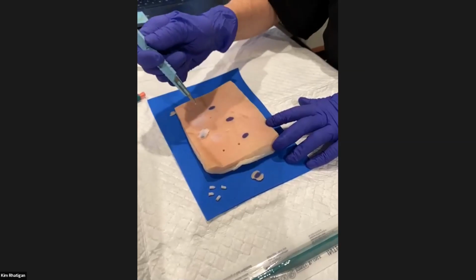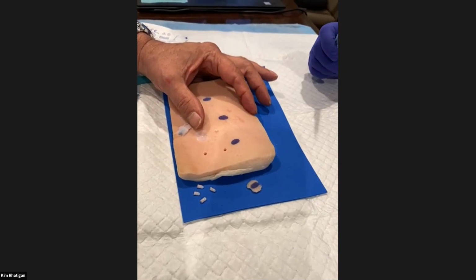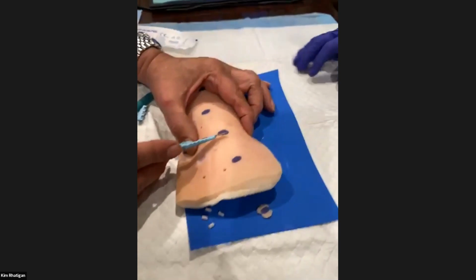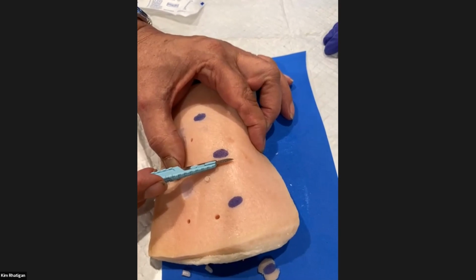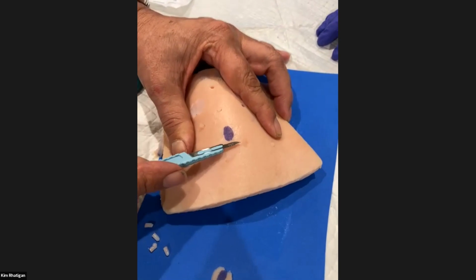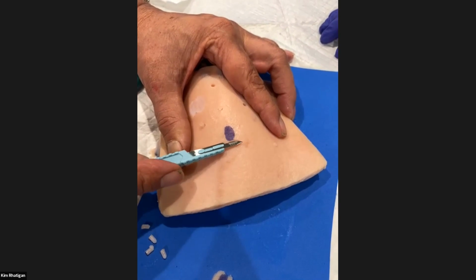In humans, you'll do one of two things: you'll either stretch the skin or squeeze the skin together. At some points, you may be cutting towards yourself, so you have to do it in a very controlled way. You start out, let me just turn it this way. At some point, you can raise this up. You'll come in at a high angle. You just want to get the blade into the skin, and then you can flatten it out.